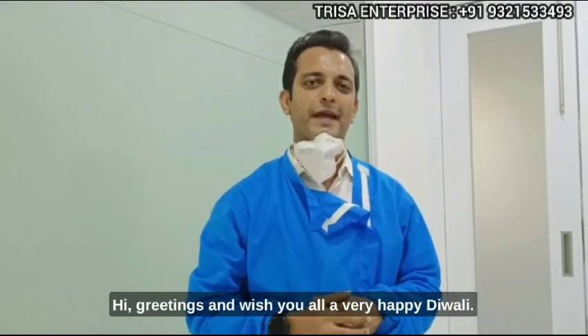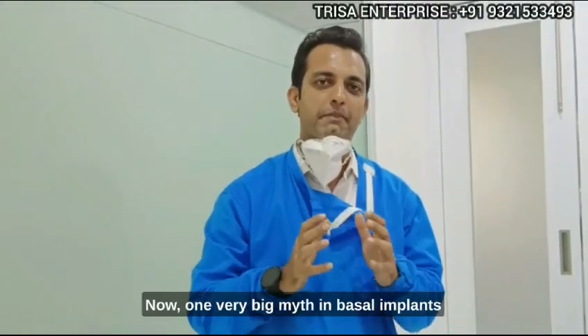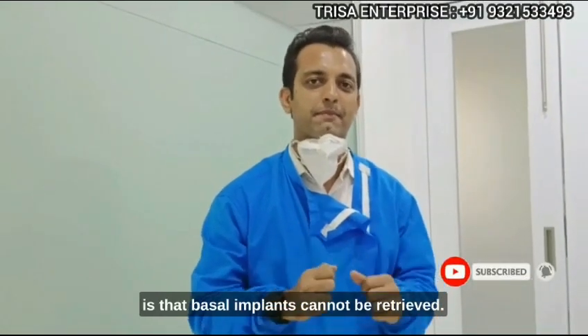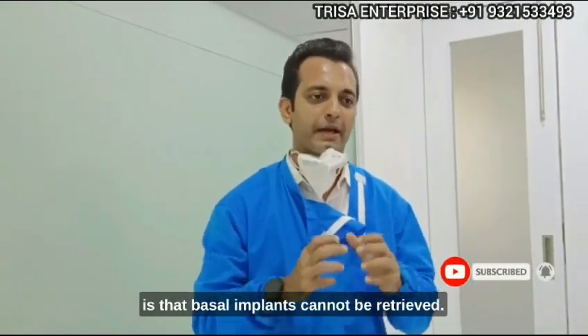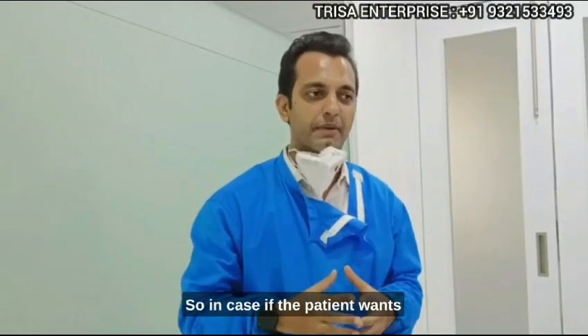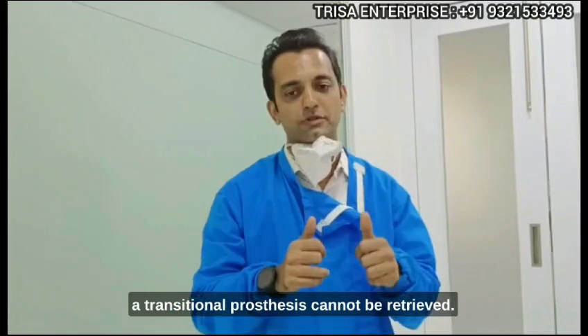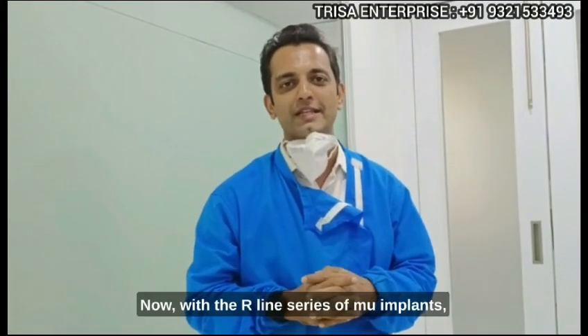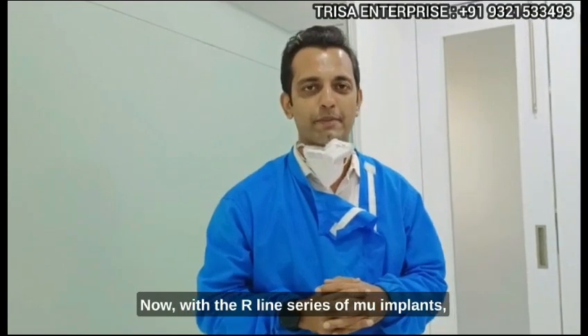Hi, greetings and wishing you all a very happy Diwali. Now, one very big myth in basal implants is that basal implants cannot be retrieved — meaning the implant prosthesis cannot be retrieved. In case the patient wants a transition prosthesis, it cannot be retrieved. But that is absolutely a myth.